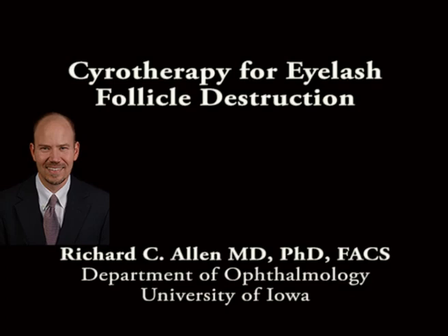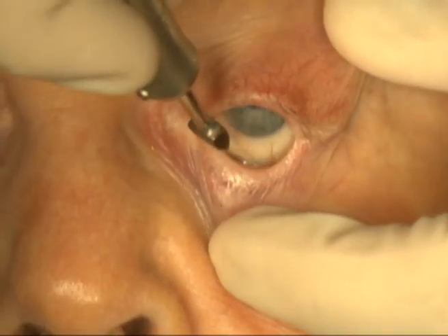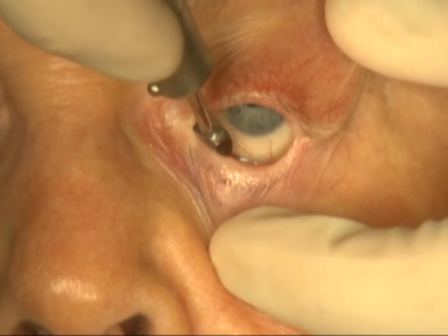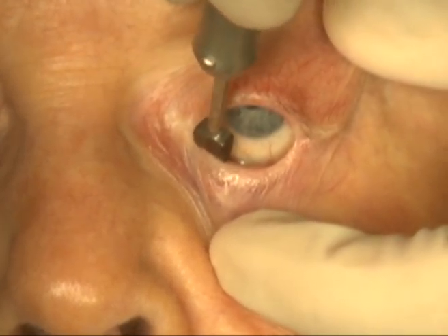This is Richard Allen at the University of Iowa. This video demonstrates the use of cryotherapy for the destruction of eyelashes. The patient has a history of a medial lateral tarsorrhaphy for exposure keratopathy, and developed an area of distichiasis postoperatively.